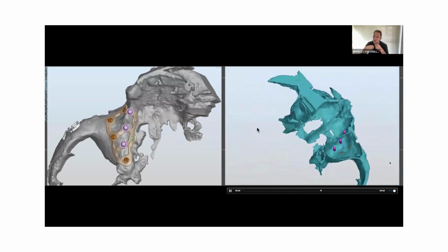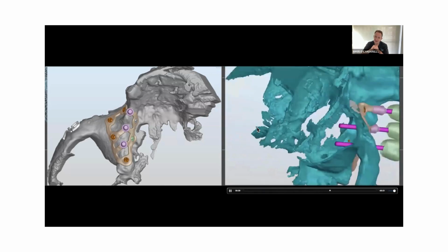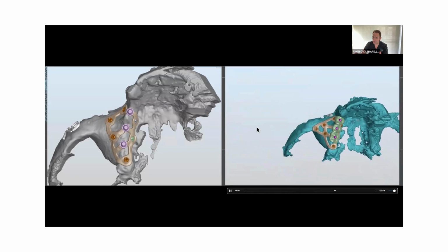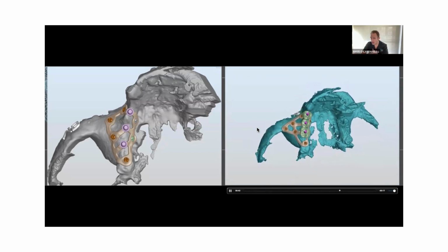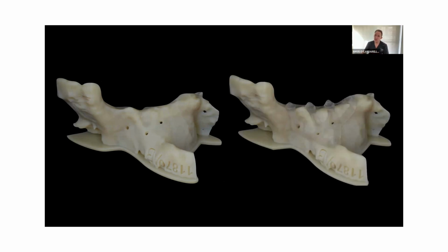Now, according to my opinion and according to my planning, it's correct. So within 3-4 weeks, we can receive the final customized implant with the 3D printing model. And I want to show this 3D printing model in order to understand how we can perform a very precise surgery using this guide and using this customized implant.